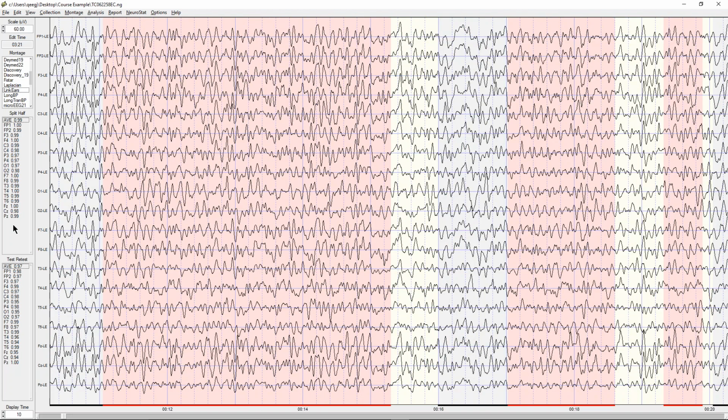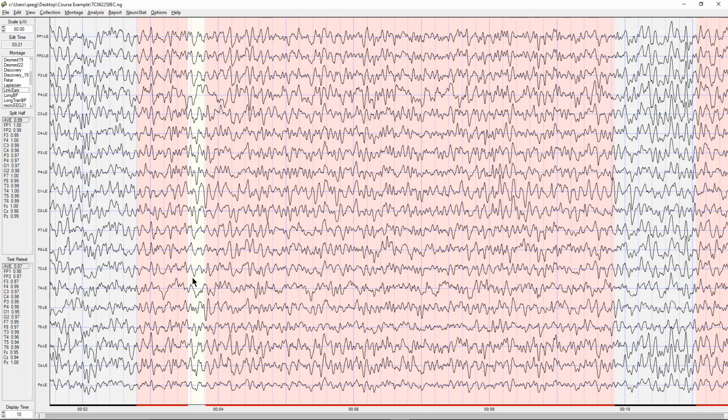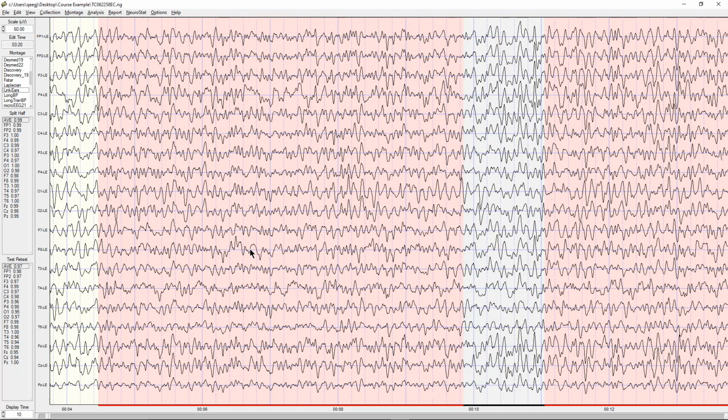And I'm going to keep an eye on my numbers over here on my split half and retest. And if I'm starting to get higher numbers, which I am, by the way, that means my rejections have been correct. That helps me to validate my corrections.